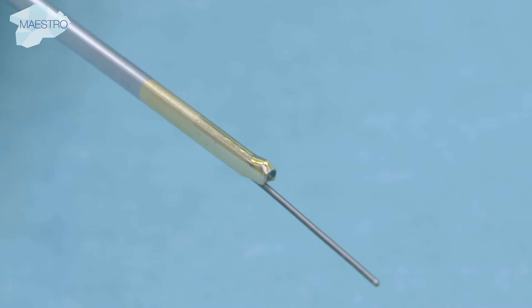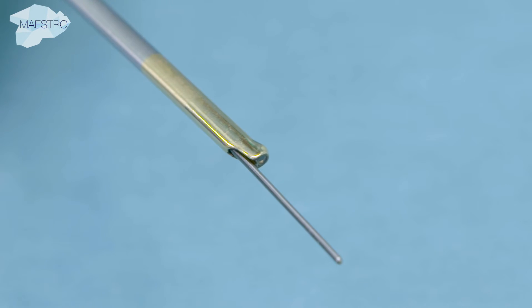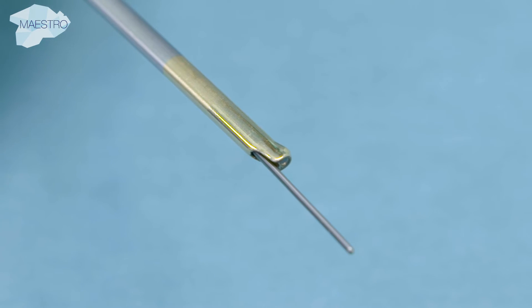Guide wires and other accessories can be inserted through the working channel. These are sized from 4.2 to 6.4 French.